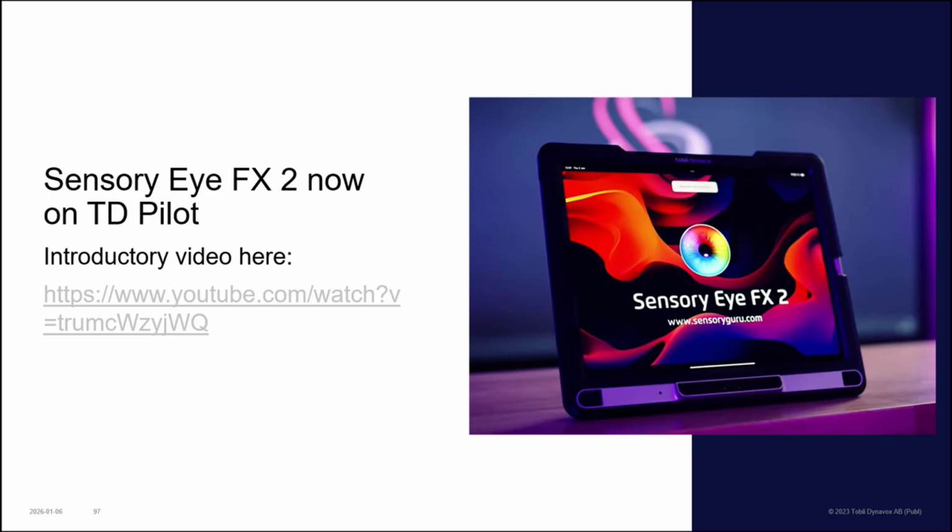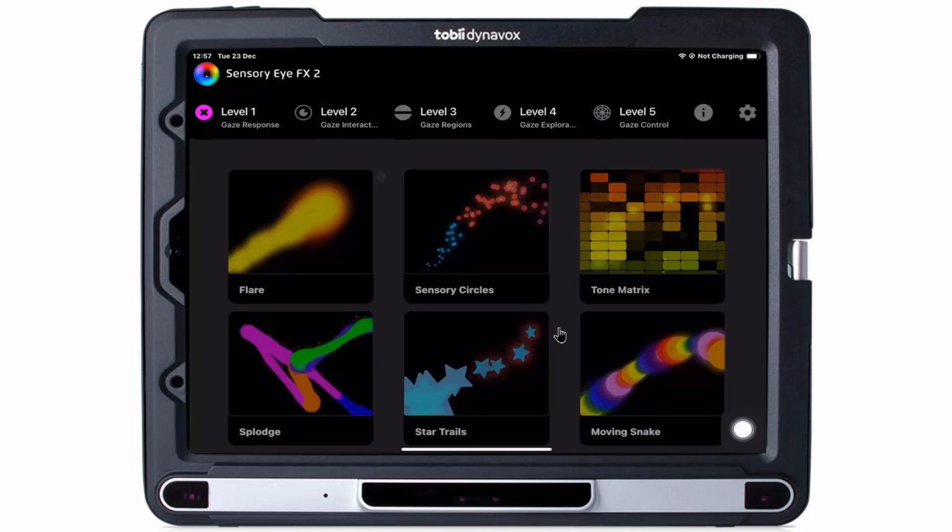This leads on very nicely to the fact that SensoryEye FX2 is now available on the TD Pilot. So SensoryEye FX2 is a much loved, structured eye gaze skills building software. We've used it for many years in the form of SensoryEye FX and SensoryEye FX2 for our Windows-based eye tracker users. So we're incredibly pleased it's now available on the TD Pilot for our iOS users. Now, I'm only going to show little bits of the software. There is a fuller video going through all of the activities and functions, so that link will take you to it, which we can send the slides. But let's have a look at this in operation.